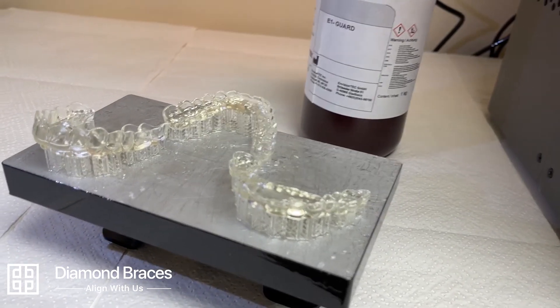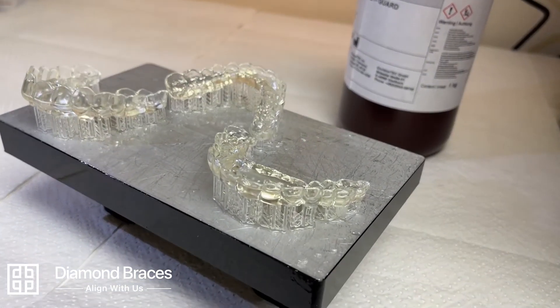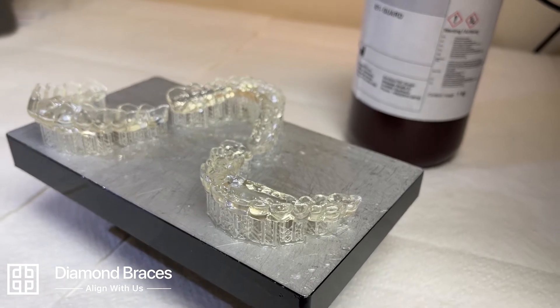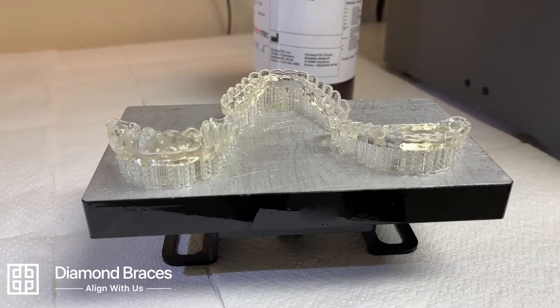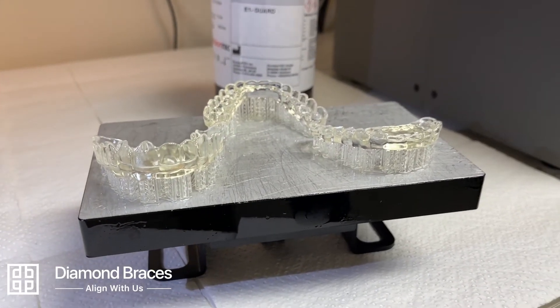Night guards manufactured utilizing this technology are superior to the traditional methods of manufacturing. The high-resolution 3D printer, along with our high-quality materials, ensures your appliance fits precisely and safely.